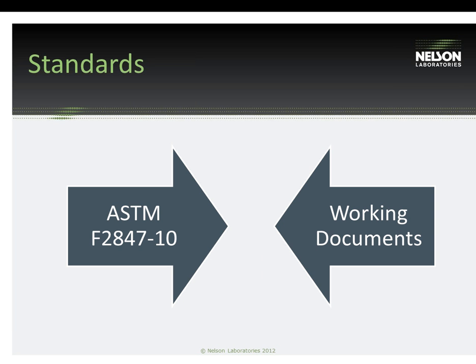The second working document that we wanted to mention is a working document in place for establishing limit values on these single-use implants. And so that's a document that's going to be in hot demand when it comes out, with more guidance on how to justify these residue levels, as there is no set acceptance criteria in the industry currently.